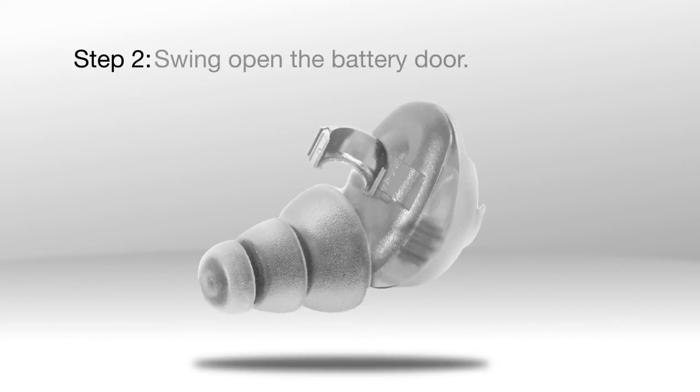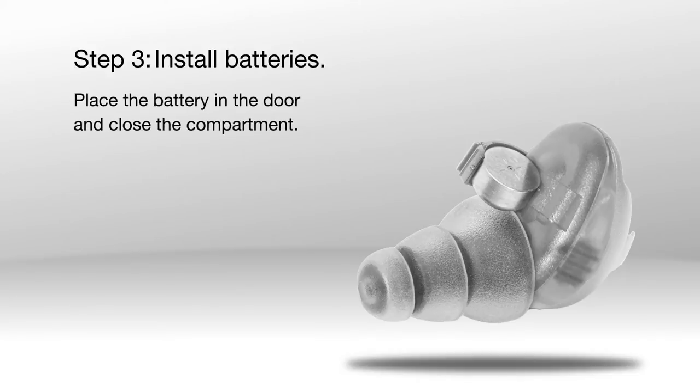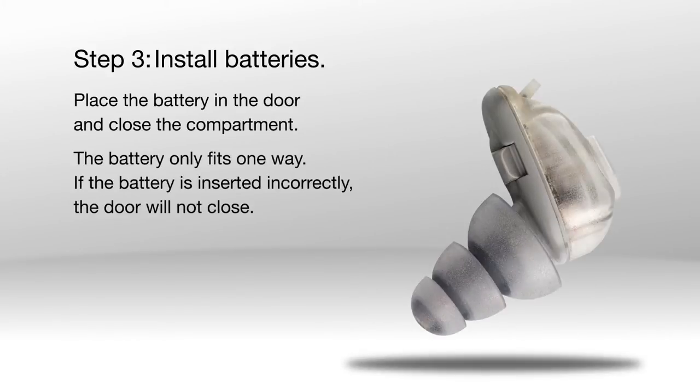Step 2: Swing open the battery door. Step 3: Install the batteries. Place the battery in the door and close the compartment. The battery only fits one way — if the battery is inserted incorrectly, the door will not close.